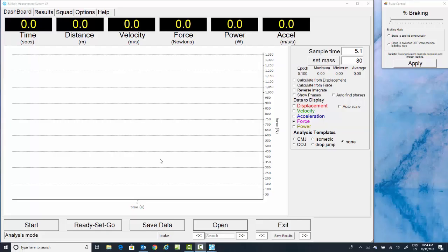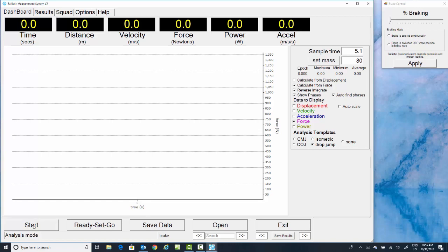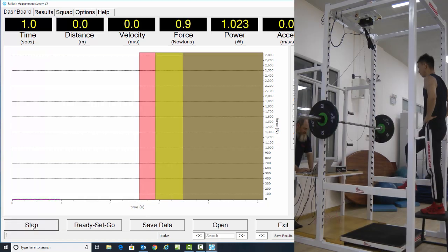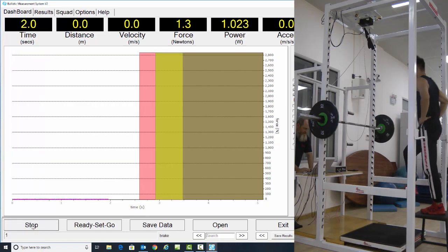We move on to the drop jump template. Go in, we select Calculate for Force, Reverse Integrate, Show Phases, and Automatically Determine Phases.